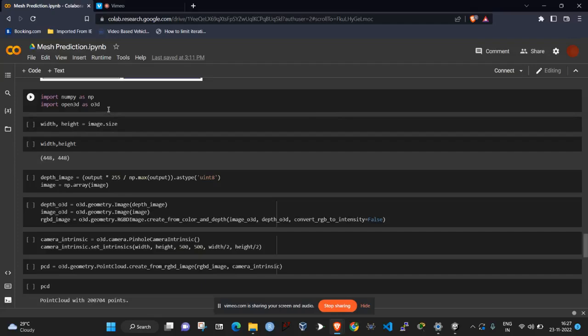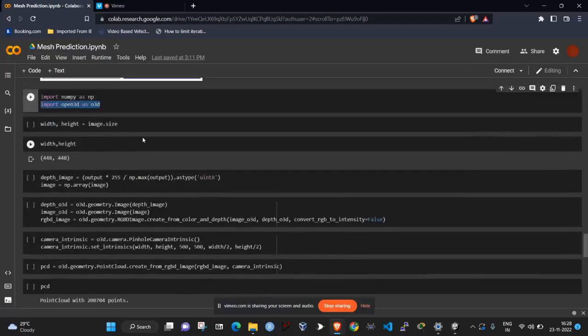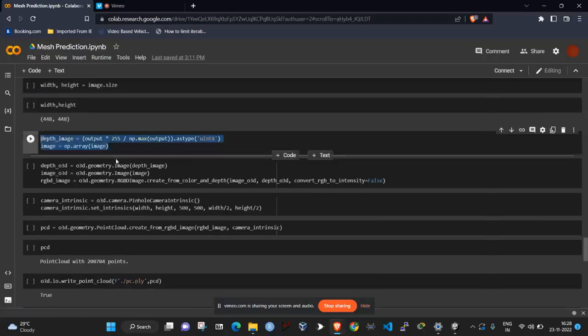down. Here we try to get point cloud data from depth maps. A point cloud is a set of data points in space. The points may represent a 3D shape or object. Each point's position has a set of Cartesian coordinates x, y, z. This point cloud conversion from depth maps is possible by a library named Open3D. Open3D is an open source library that supports rapid development of software that deals with 3D data. The Open3D frontend exposes a set of carefully selected data structures and algorithms in both C++ and Python. Normalizing the depth map to get the point cloud is achieved in the shown lines of code.